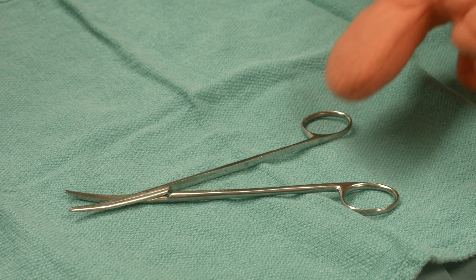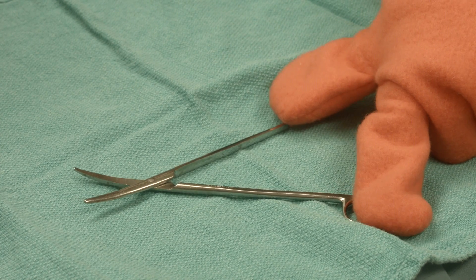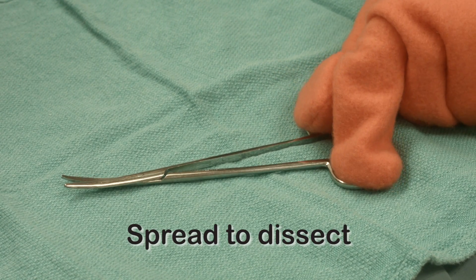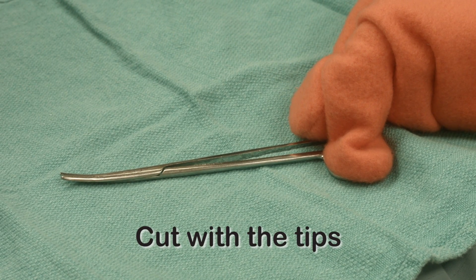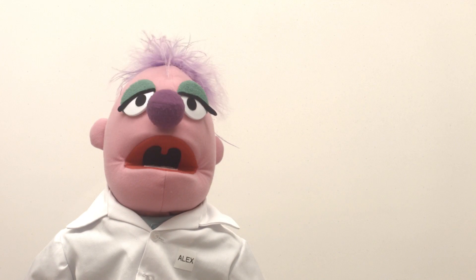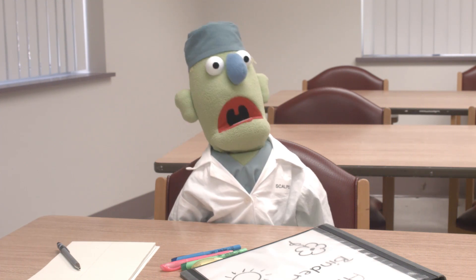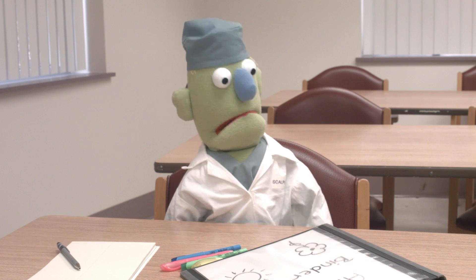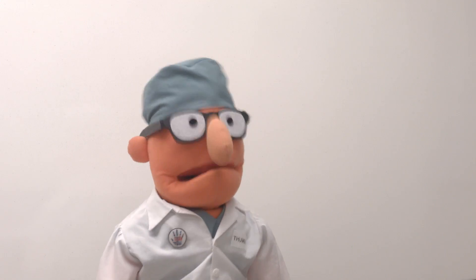Let's look at how we use tissue scissors to dissect tissue. You put your thumb here and your ring finger here, and then use the scissor tips to gently spread the tissue planes apart. When you're ready to cut, reverse the action and use the tips to cut. It might look easy, Alex, but it takes a long time to master — knowing how to recognize tissue planes and when and where to cut.